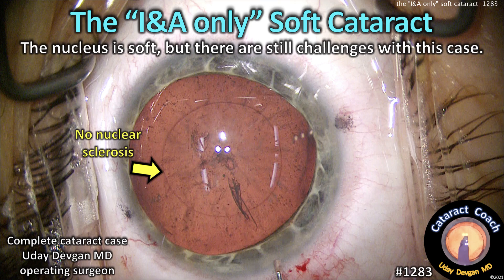CataractCoach.com — the IA-only soft cataract. The nucleus is soft, but there are still some challenges with this case.